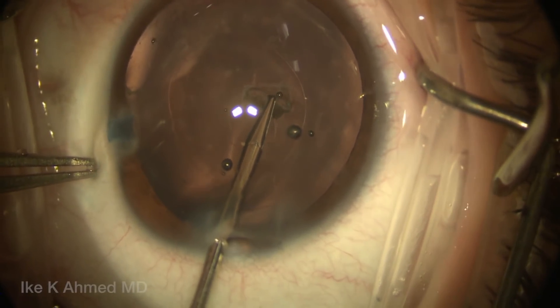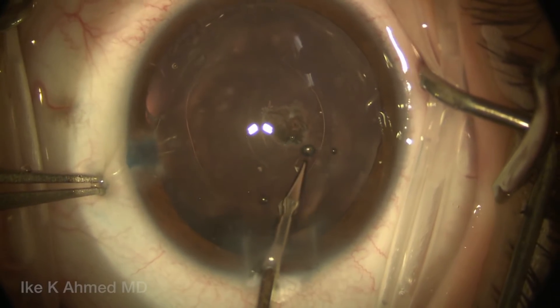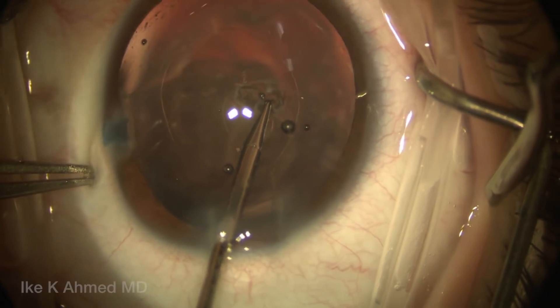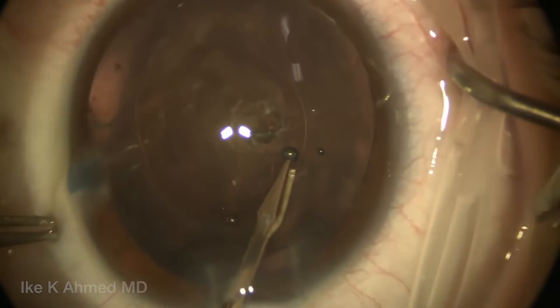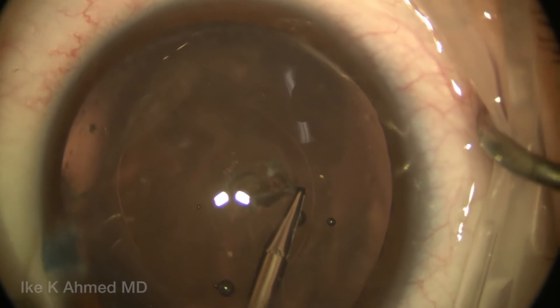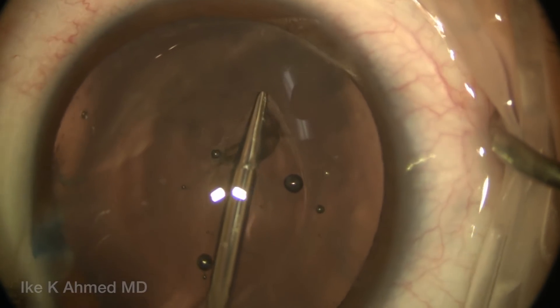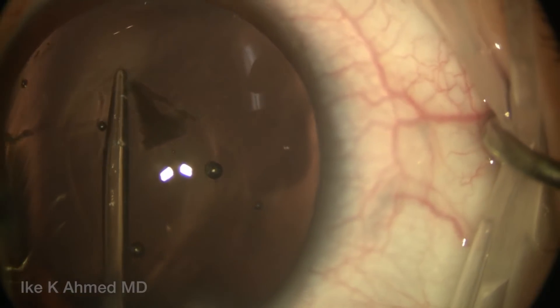They're going to use a micrograsper to perform the posterior rhexis. We're performing the posterior rhexis, which we do for all our pediatric cataracts less than the age of 4. What's important here is to prevent any visual axis opacification, which is of course a concern in these young patients. This patient has posterior polar opacity as well, which we need to remove to enhance visual rehabilitation.